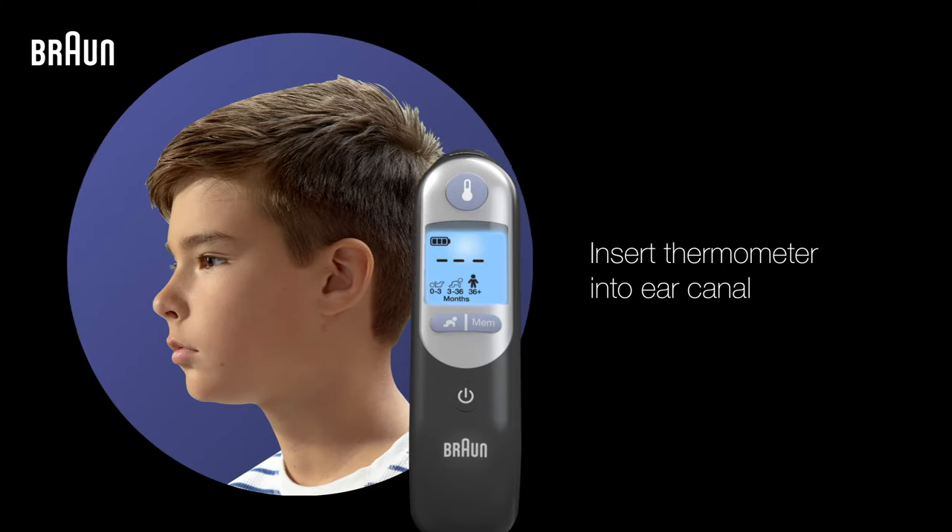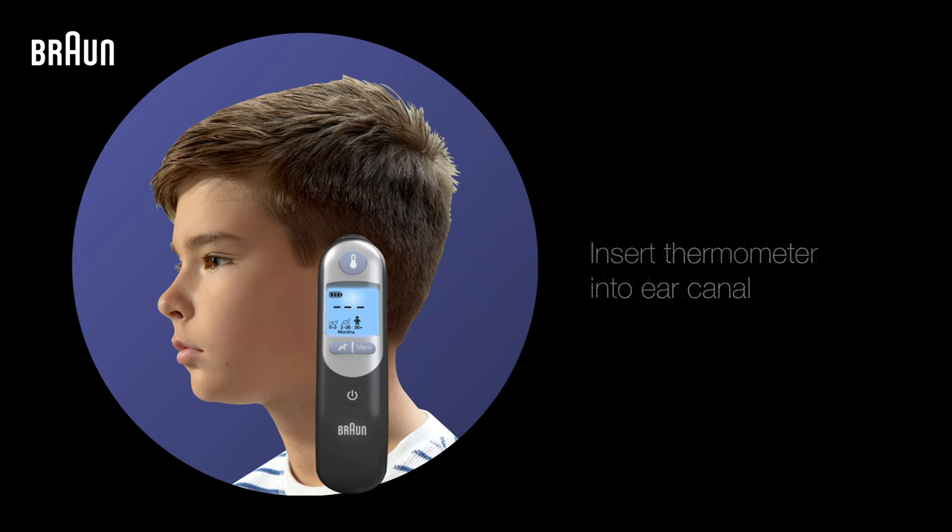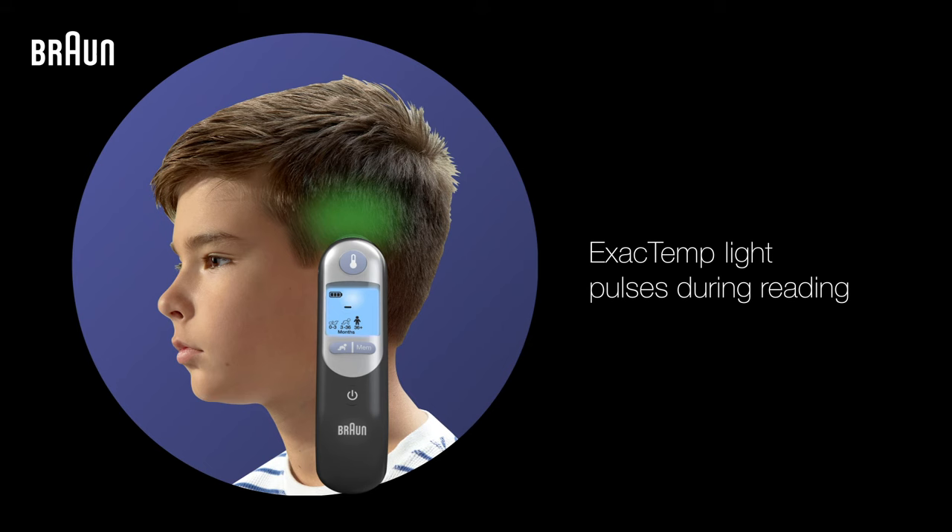Once the age range has been selected, insert the thermometer probe snugly into the ear canal. Then press and release the Start button. Your thermometer's exact temp light will pulse while it reads the temperature of the eardrum.